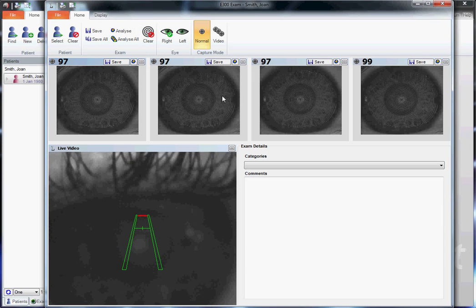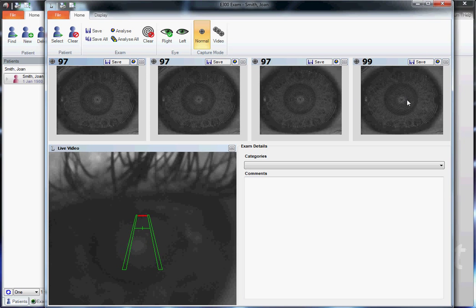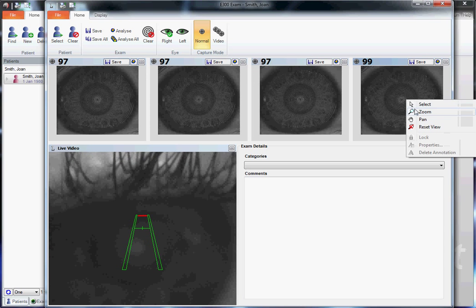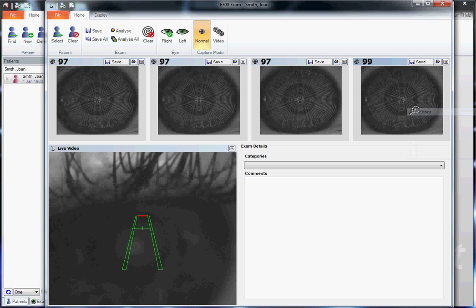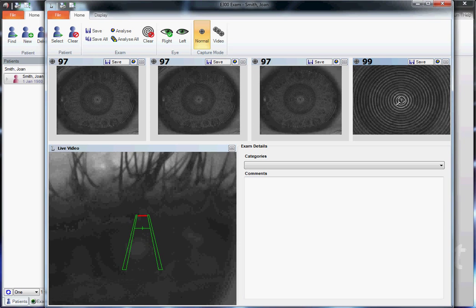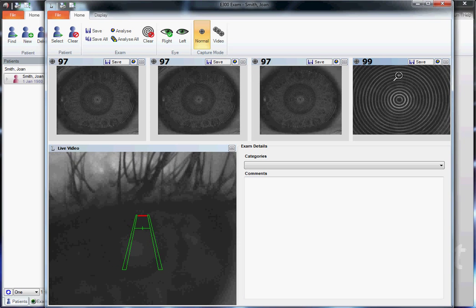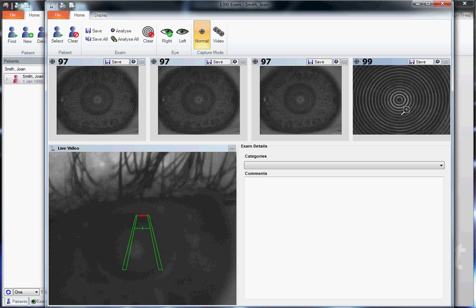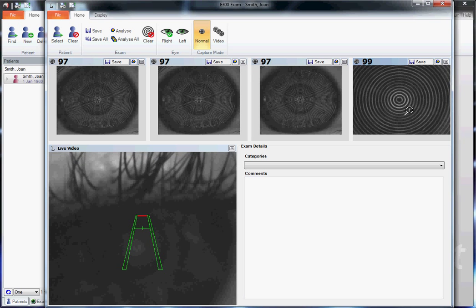The quality scores read 97, 97, 97, 99. Right-click, select the zoom tool, zoom in, and make sure the rings look parallel and even.